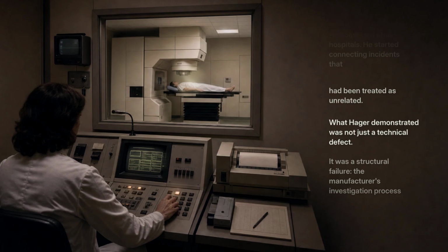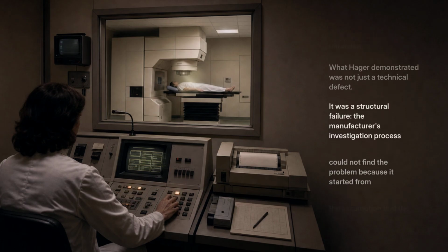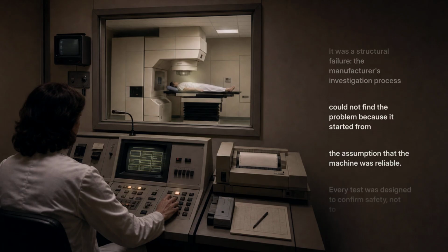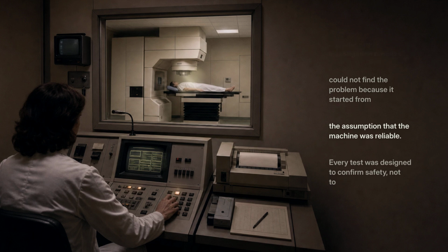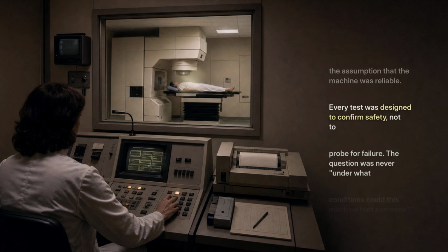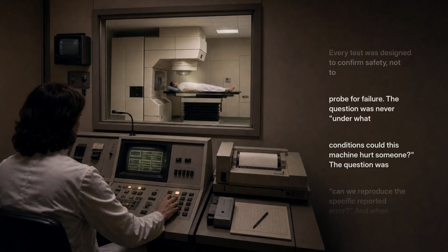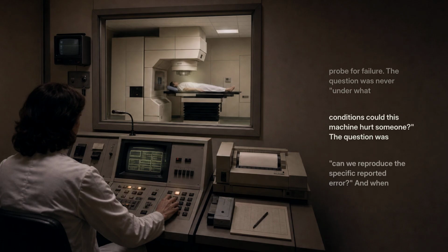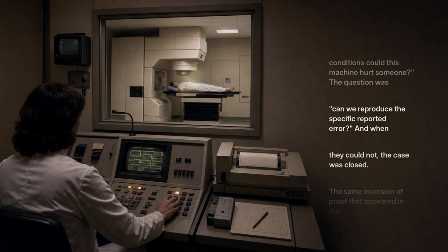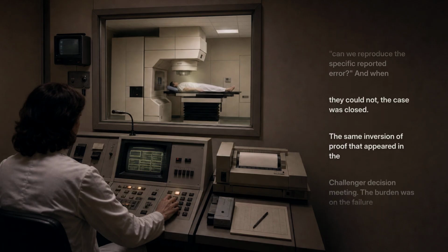What Hager demonstrated was not just a technical defect. It was a structural failure. The manufacturer's investigation process could not find the problem because it started from the assumption that the machine was reliable. Every test was designed to confirm safety, not to probe for failure. The question was never, under what conditions could this machine hurt someone? The question was, can we reproduce the specific reported error? And when they could not, the case was closed.